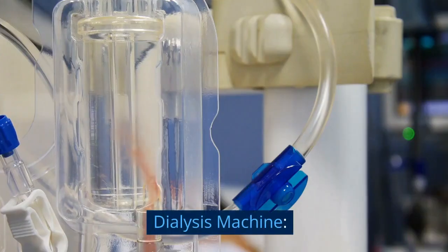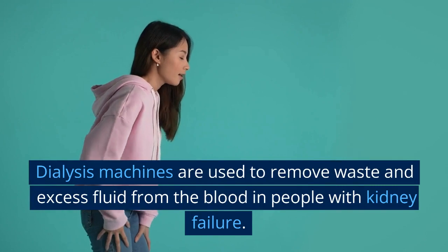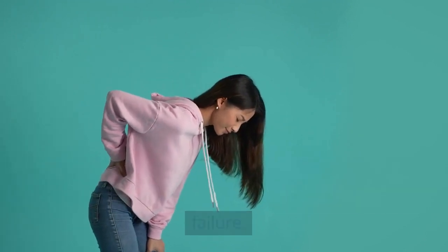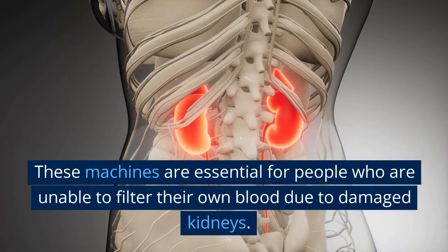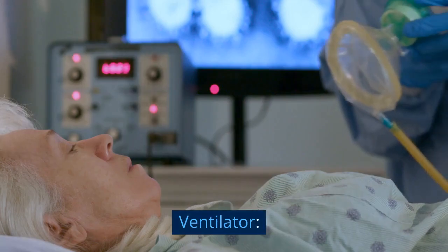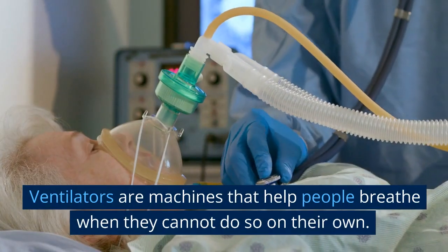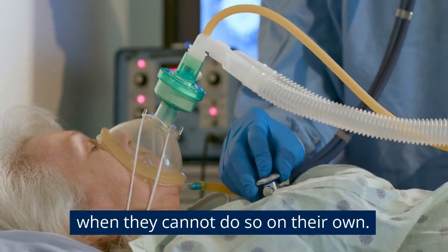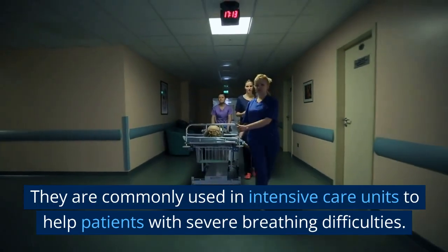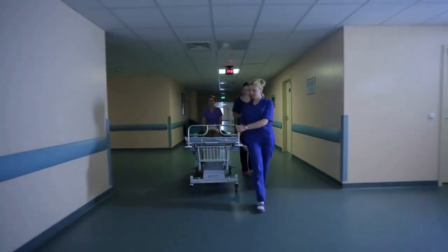Dialysis machines are used to remove waste and excess fluid from the blood in people with kidney failure. These machines are essential for people who are unable to filter their own blood due to damaged kidneys. Ventilators are machines that help people breathe when they cannot do so on their own. They are commonly used in intensive care units to help patients with severe breathing difficulties.